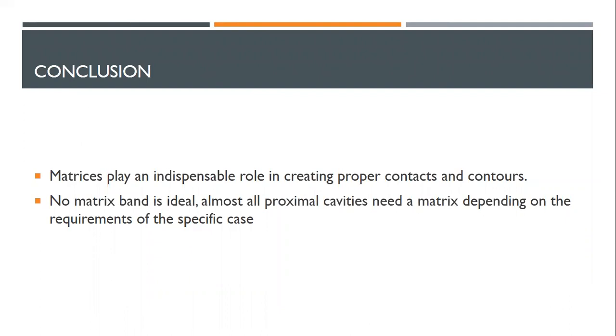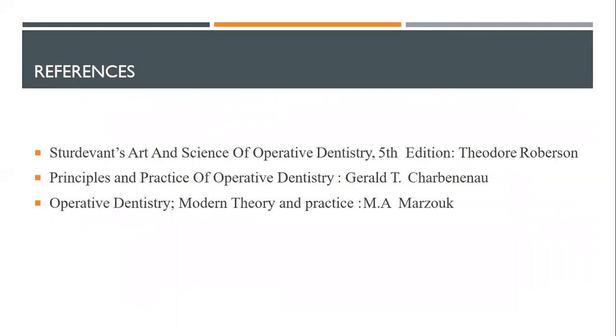Moving on with the conclusion, matrices play a very indispensable role in creating proper contacts and contours. No matrix band is ideal. Almost all proximal cavities need a matrix depending on the requirement of the specific case.